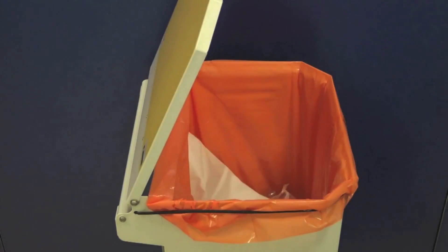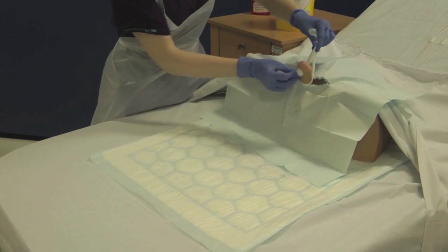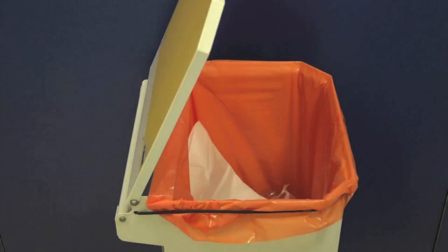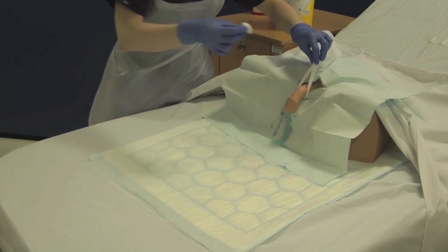UHL policy utilises a clean hand, dirty hand technique as demonstrated here. Use your clean hand to pick up the sterile cotton wool balls and pass them to your dirty hand. This ensures that your sterile field is not contaminated. The dirty hand is the only hand that touches the genitalia.